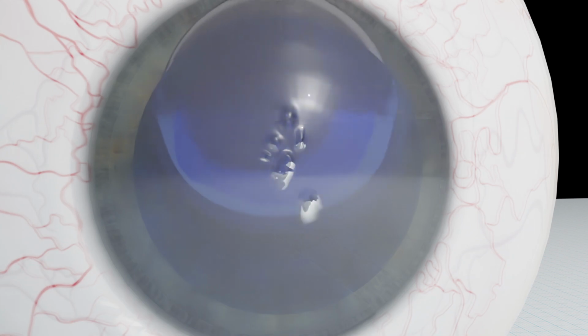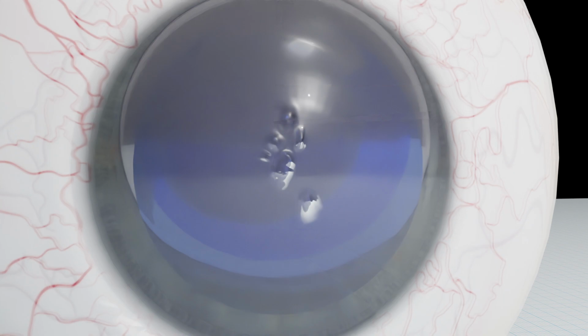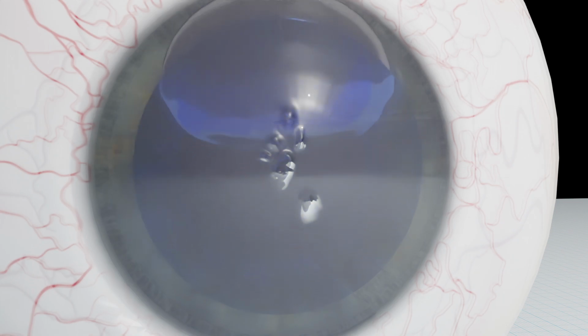We then inject an air or gas bubble to attach the graft to the inner surface of the cornea, where the unhealthy cells originally were. We leave the gas in for about 10 minutes and then remove some of this at the end of surgery, and sometimes also an hour or so after surgery. The remaining gas bubble then gradually absorbs over a few days.